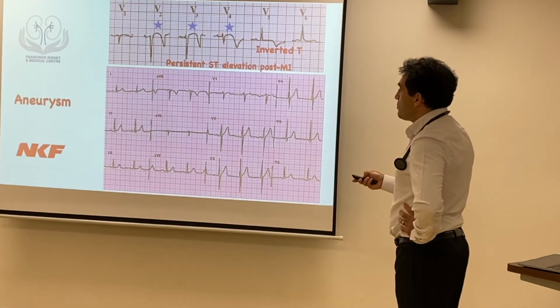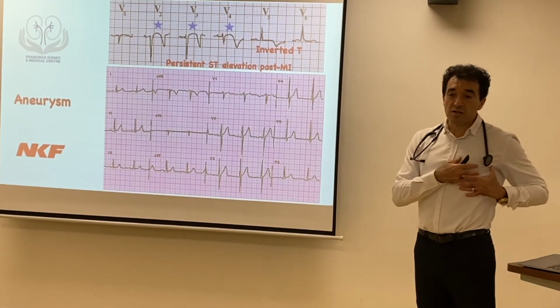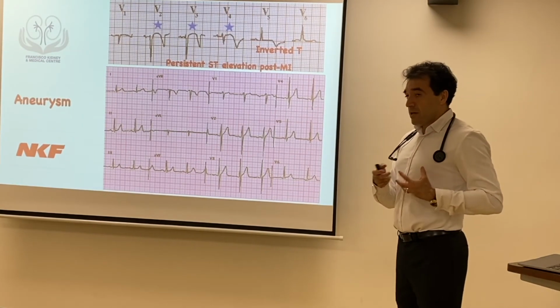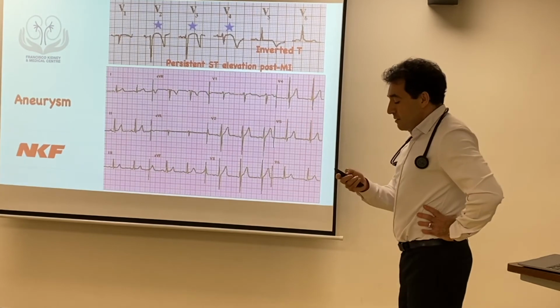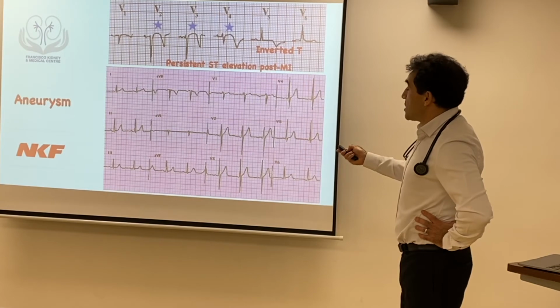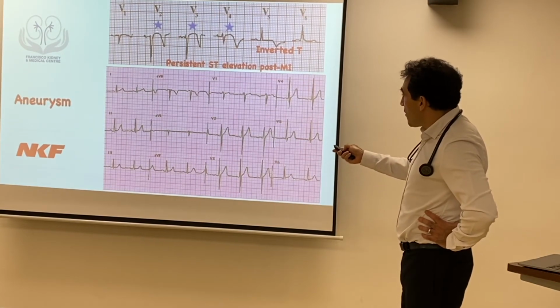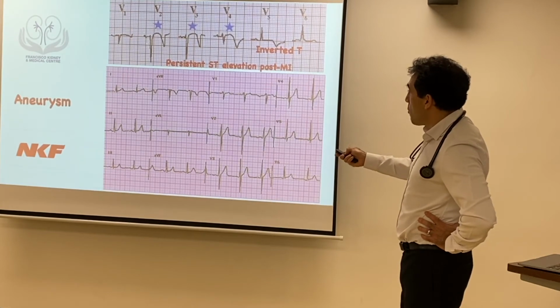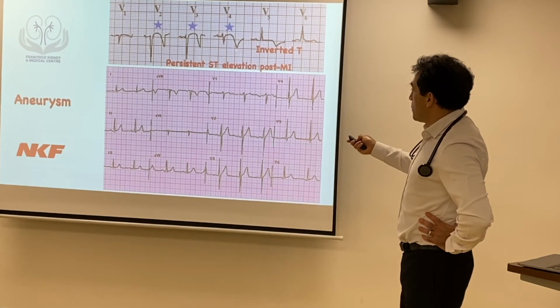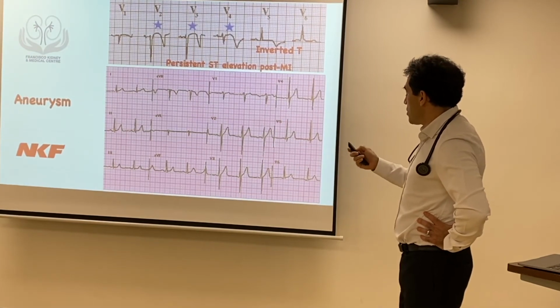And aneurysm, like the fistulas, aneurysms can also happen in the heart. There is a myocardial infarction, the wall gets weakened and then can dilate. And after an MI, typically, if this persists for around 3 weeks and there are still the elevations, and they typically look quite round, quite convex, it's probably an aneurysm, yeah, as you can see here.